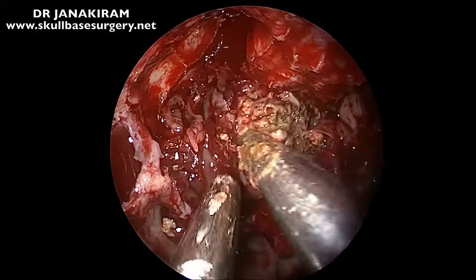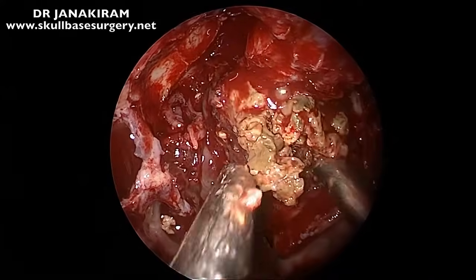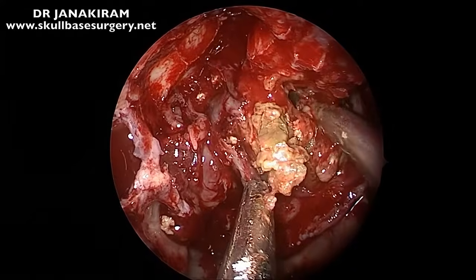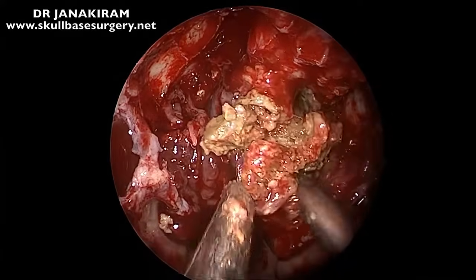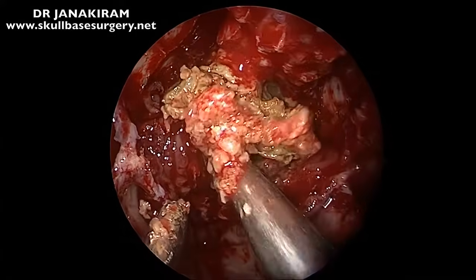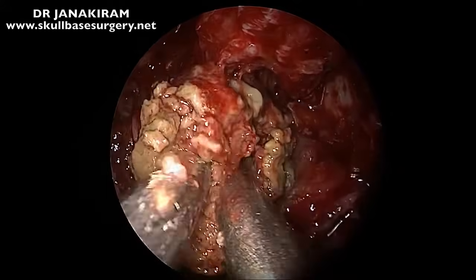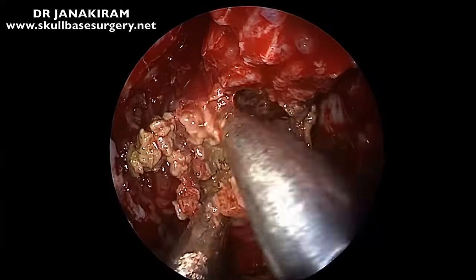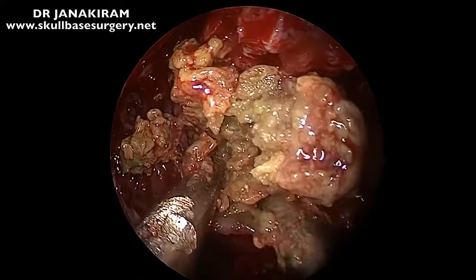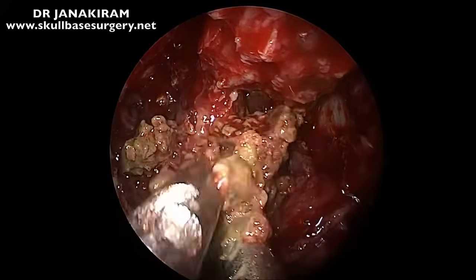The septum in the posterior end was eroded, so it was easy for us to perform a binostril technique. You can see that the sphenoid is filled with fungus. In such a situation, there are two ways of removing this fungus. One is by applying suction, as we're doing here, or by irrigation.